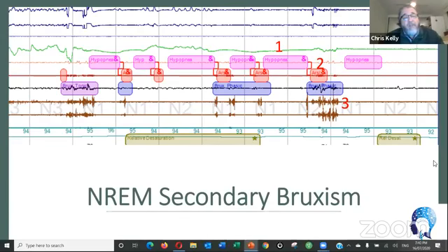Then you've got a blue line, and beneath that a brown series of lines, and you can see some disruption in the line. That is phasic bruxism happening because it's a high pointed short duration spike. Then you've got a series of 3 versions of that, and a couple of them have twins, so that's more phasic bruxism in amongst hypopnea.